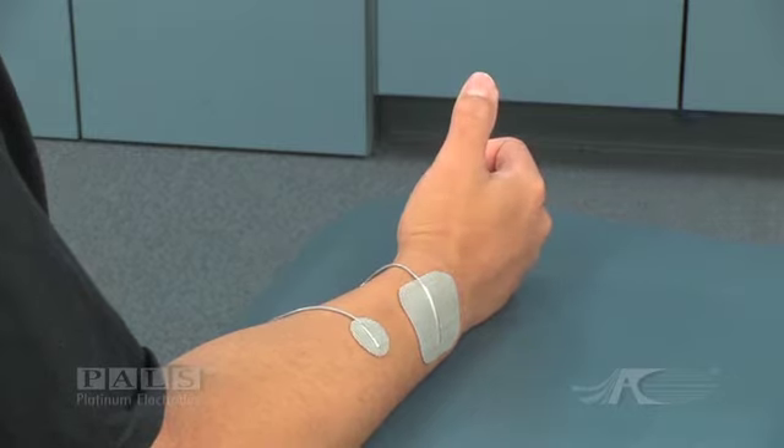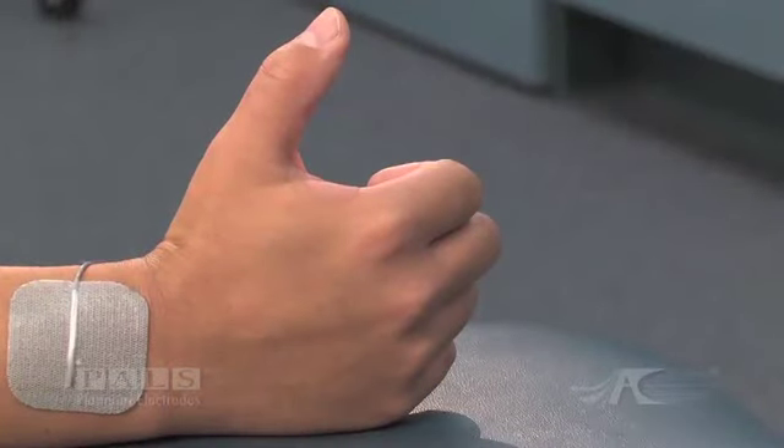Stimulation results in isolated thumb extension, which would be graded three out of five in a muscle grade.